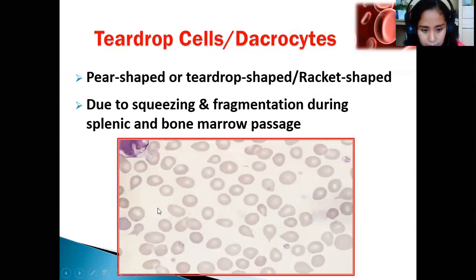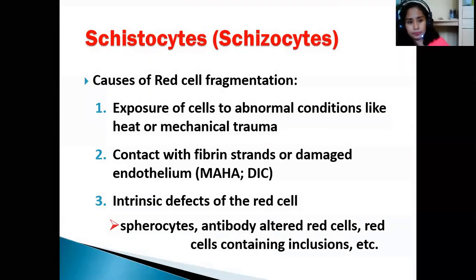Class, if you will notice this image, pansin yung dulo. No teardrop shape. Is it pointed to different direction? If it's pointed to different direction, class, it's really a teardrop cell. Pero pag it's pointed to a single direction, lahat nung patulis is pointing on one direction, artifact daw yan.